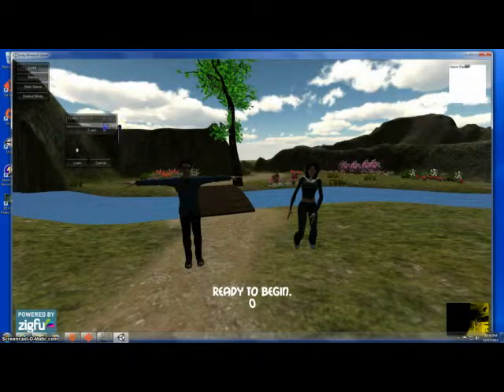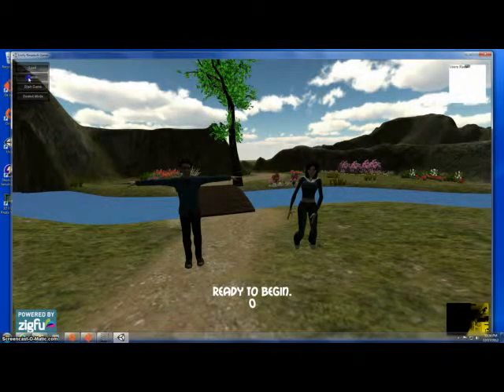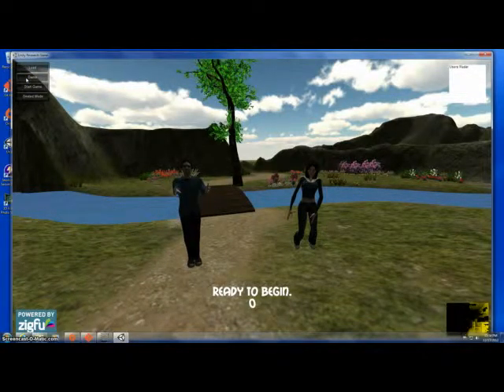After the file is loaded, the patient can press the demo button. Now, the demo button shows a quick preview of the full exercise. It gives the patient an idea of what the exercise entails before actually asking them to complete it.